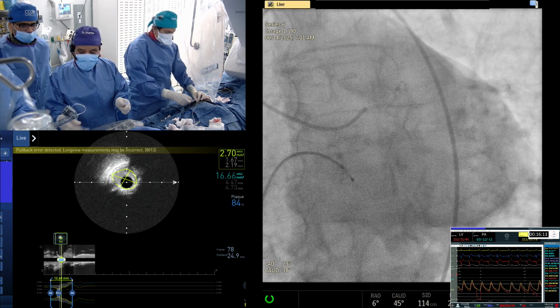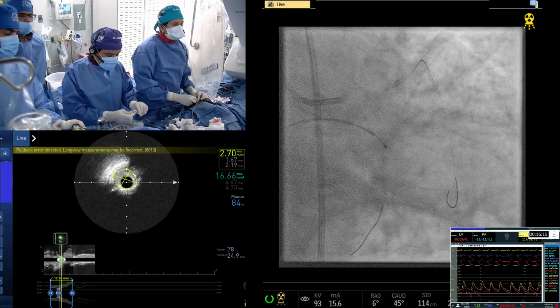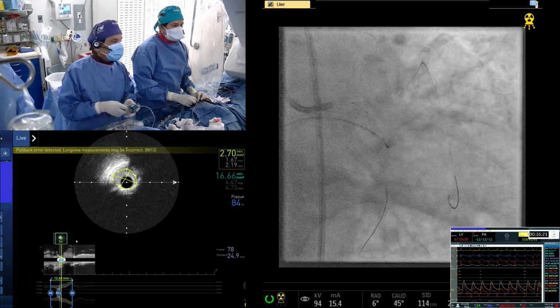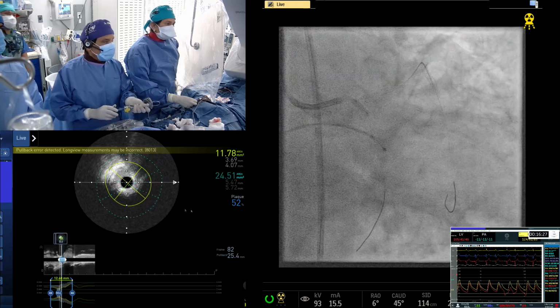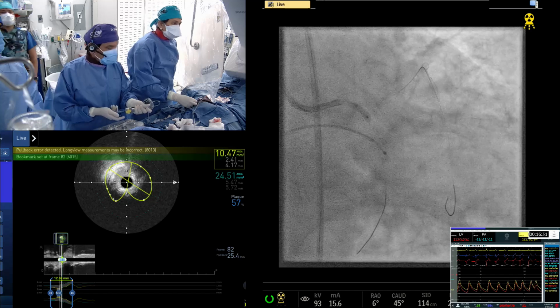A lot of people say, well, maybe after this, you can just do a drug-coated balloon in this large vessel. There's a lot of discussion happening at present, particularly from Europe, because the initial bifurcation trial has been very positive, but there are very few left main cases. Now people are trying to do even drug-coated balloon for the large circumflex and just cross over.